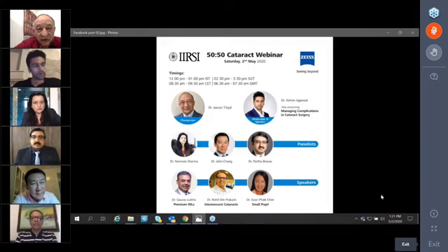For younger patients, less than 20, most of them will be maybe unilateral cataracts like trauma or other causes. If there's a trauma, yes, the other eye will be normal. In such cases, maybe trifocal will be best in today's generation, or the newer thinking of the enhanced type of lens, which gives you a depth of focus and gives a near vision, doesn't compromise the distant vision, may be good for younger generation patients. I'm waiting for future developments of trifocal in combination with spherical aberration change in the lens in the central optics.